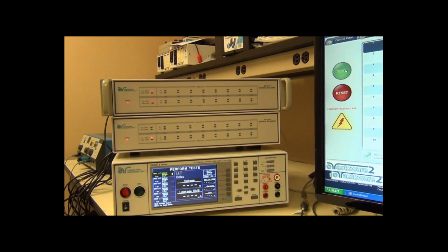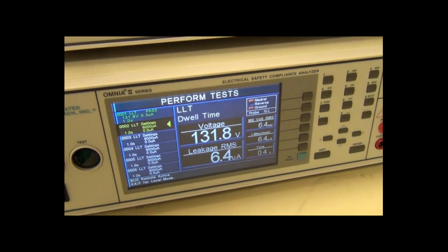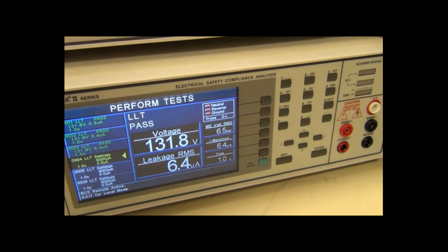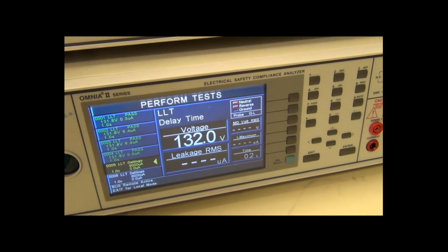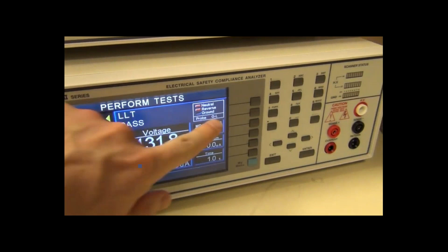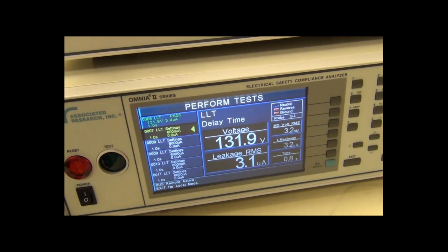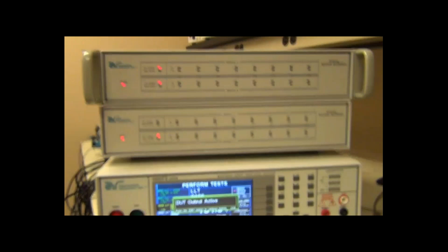So what we can see here is the Omnia running through the test. We can see the voltage, we can see the leakage current measurement, we can even see the fault conditions here. Currently we're on step 4. Here's step 5, so we're still on earth leakage, and we can still see we have a G to L probe configuration here. Step 7, step 8, and now step 9, we're going to start going through various patient leads.